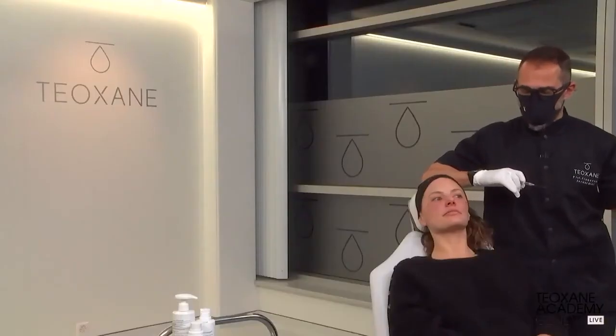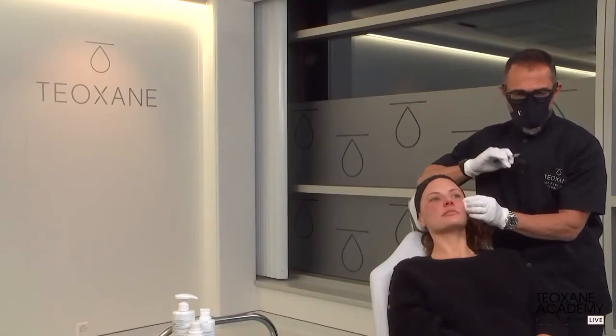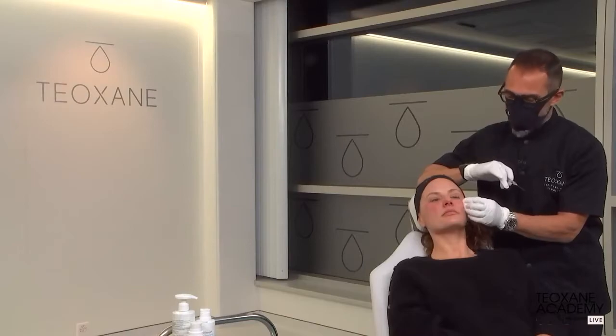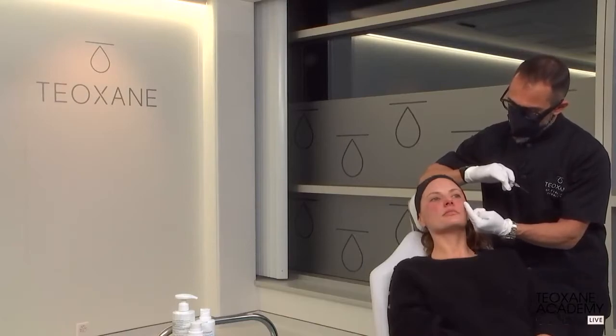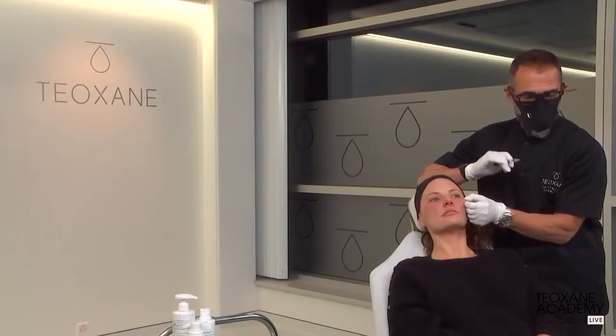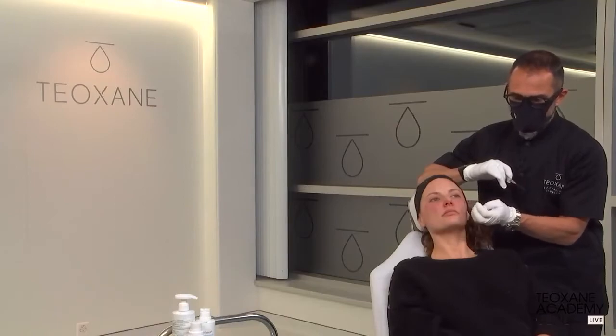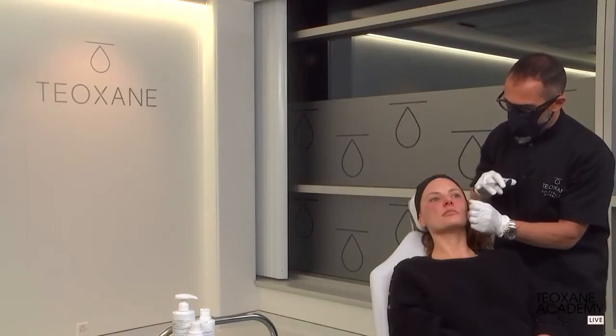Well, I pointed out that there is a zygomatic facial artery, but definitely you don't want to. The beauty of this dynamic, resilient hyaluronic acid is that you don't have to be all the way attached to the bone. You can inject a little more superficial. And when I use a needle, I come from down below, I grasp the tissue like that, I lift it up, so the vessel will stay down. I'm a little higher. I'm not really on the bone, so I play safe.